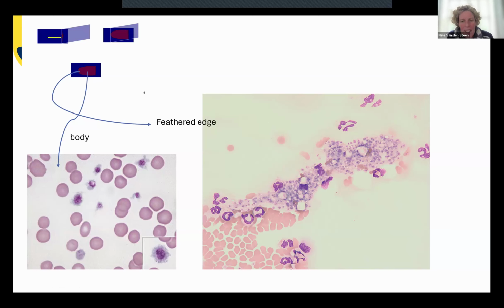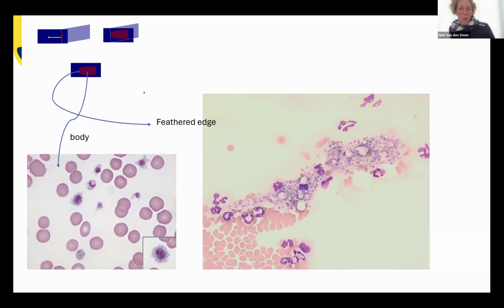If there are, then that will stop those platelets from being counted, and you're not going to be able to trust your machine. But if there's that high number, you probably have a reasonable number of platelets.